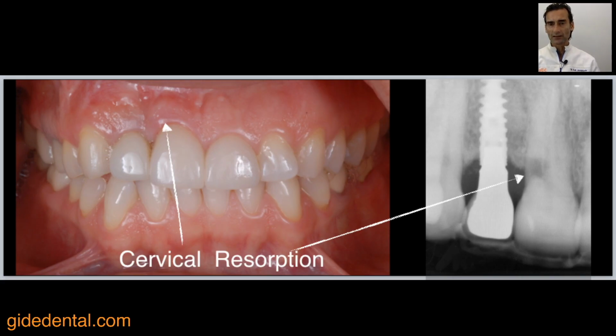You can see that there is a coronal gingival margin, which is more apical in the tooth number 8 versus the tooth number 9. We diagnosed the patient for a possible lengthening of the gingiva, and we also looked at the option to maybe improve the vertical length of the teeth with some incisal lengthening. So let's look first at the patient, the way she looks.